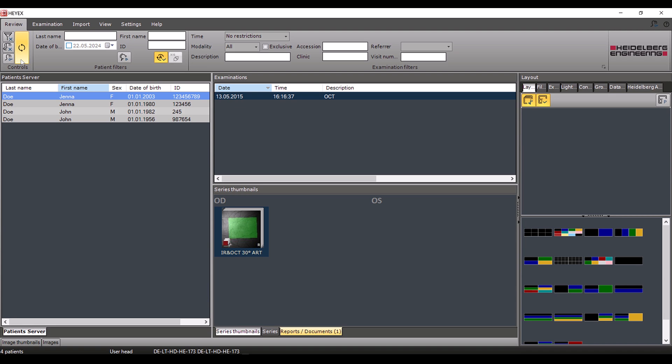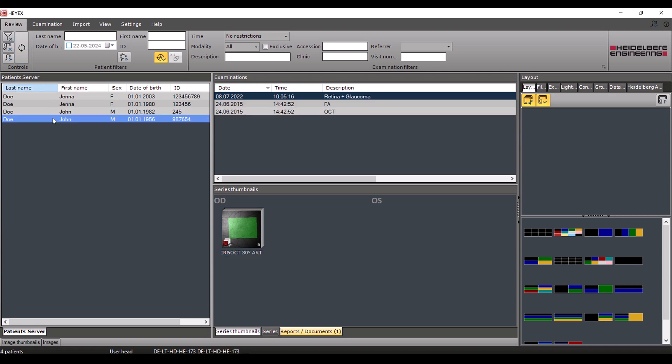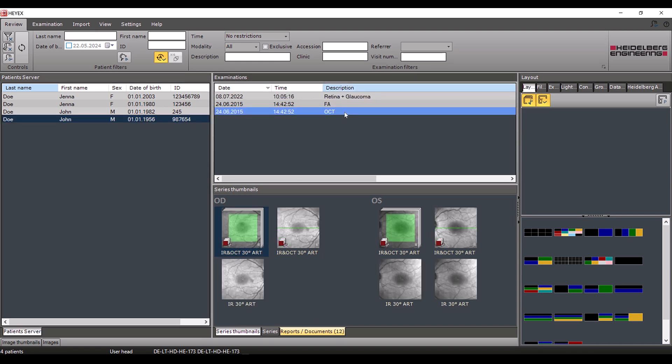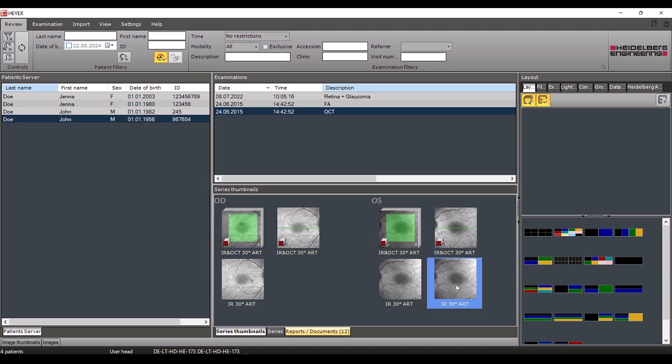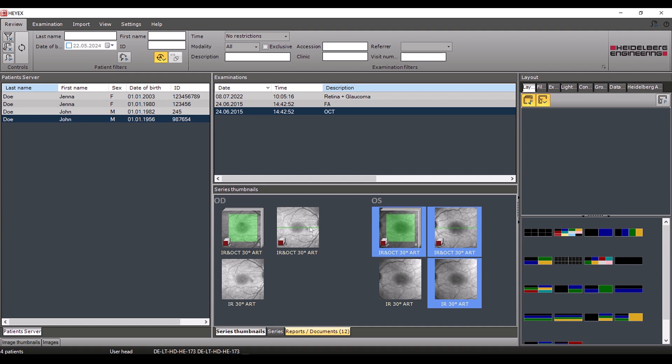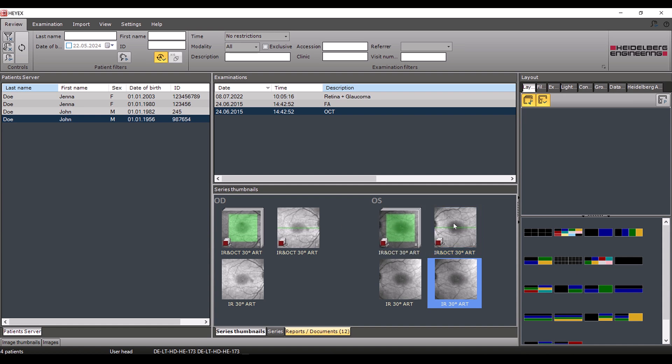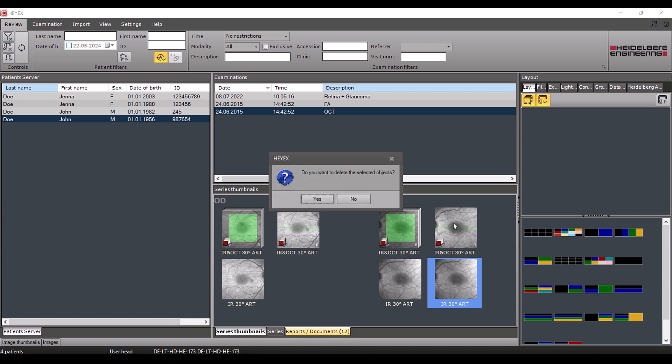To delete data, select the element to be deleted, for example a person, an examination, or a single acquisition, and then press the delete key on your keyboard. If you want to select multiple entries, press and hold the control button while selecting the desired data. Selected elements are always highlighted in blue, in our case the single acquisition. After you have pressed delete, you have to confirm the deletion by clicking yes.